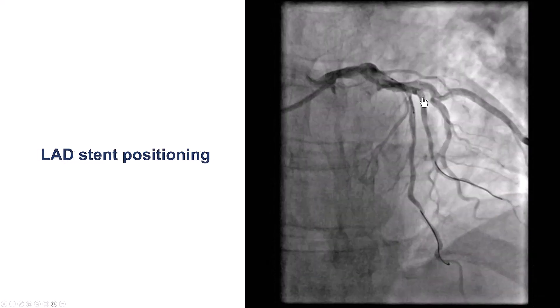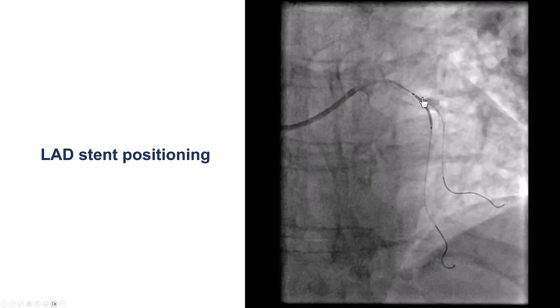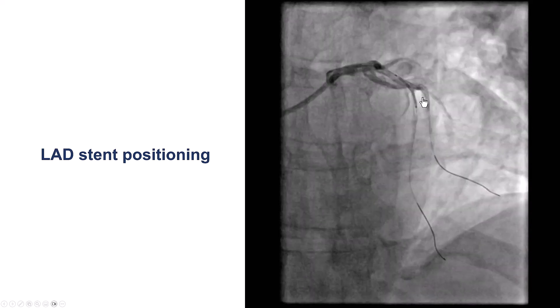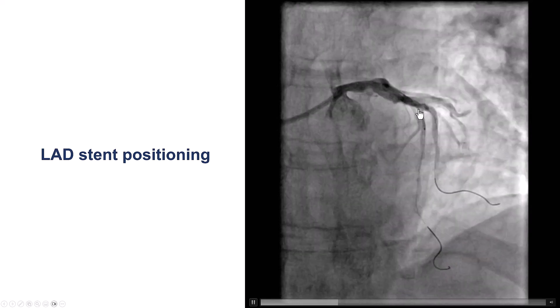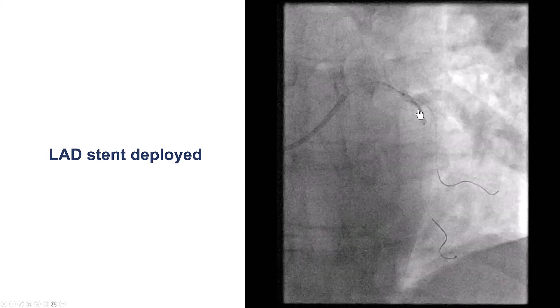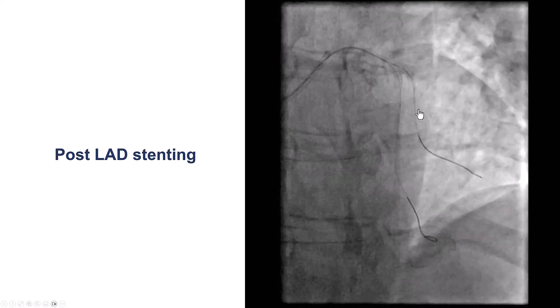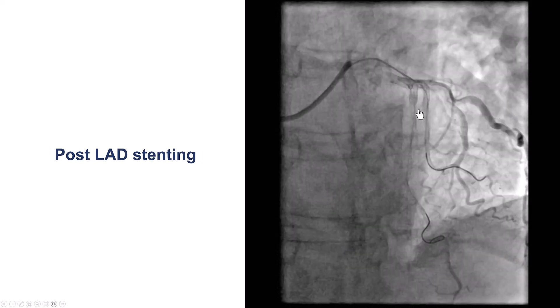We did have the balloon there, so we did the balloon inflation, crushing the diagonal stent. Then, after we rewired, we did the first kissing balloon inflation, and then we placed the LAD stent across the origin of the diagonal branch. We deployed the LAD stent, jailing the diagonal, and we now have good flow, but we need to rewire and do the final kissing balloon inflation.